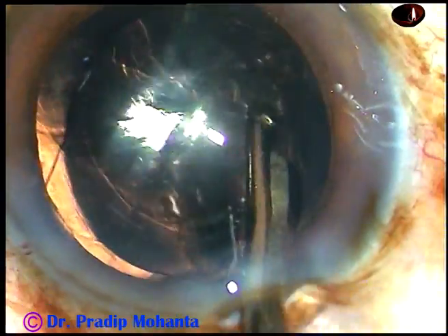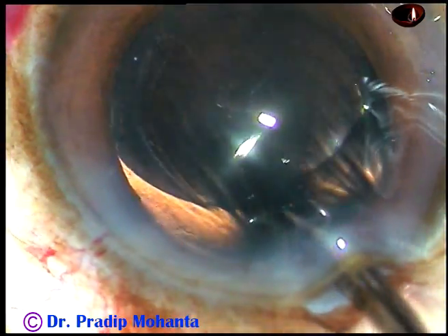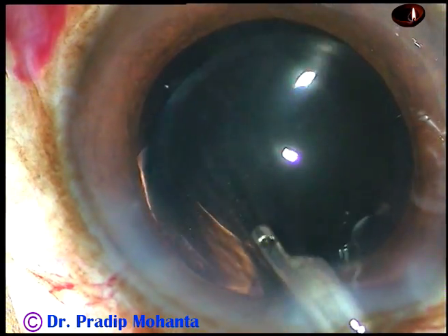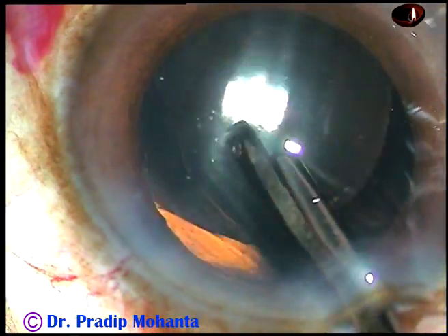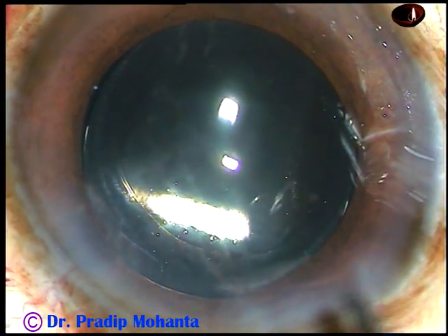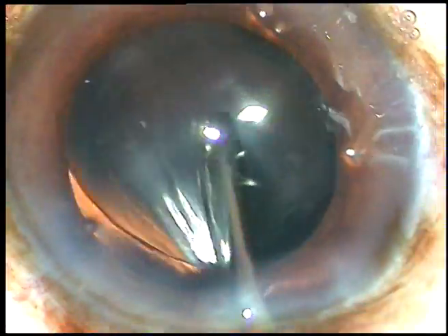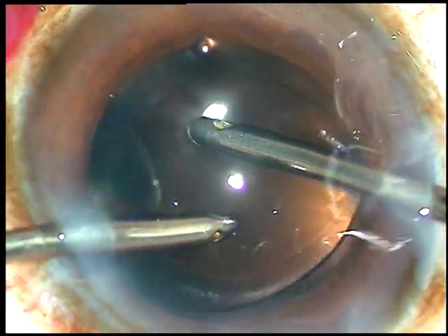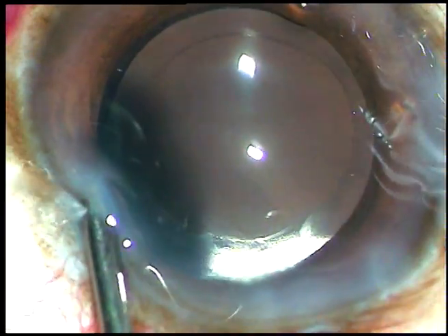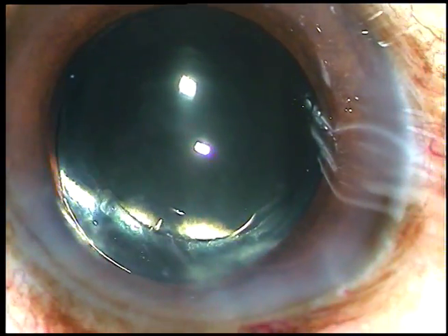And now the viscoelastic that has been used for implantation of the intraocular lens should be removed very nicely. I go behind the IOL and irrigate the capsular bag, then enter the anterior chamber and irrigate the AC to remove the visco. The irrigating probe of bimanual IA is used. The bag is again irrigated and finally irrigation and aspiration is used together — see the anterior chamber is shining. There is no visco after thorough cleaning of the anterior chamber.